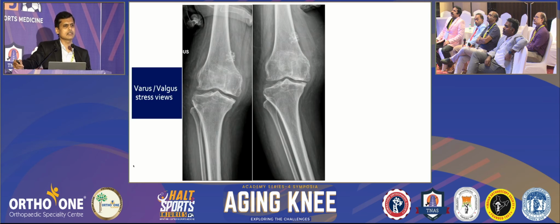So for that, definitely the stress views help a lot, whatever the approach might be, to start with, for all of us conventionally doing TKRs in these kinds of cases. So it has to become a routine in our practice. Now in this case, if you see, you don't need much release at all. Now Anup, will you change your plan about the kinematic, conventional kinematic?